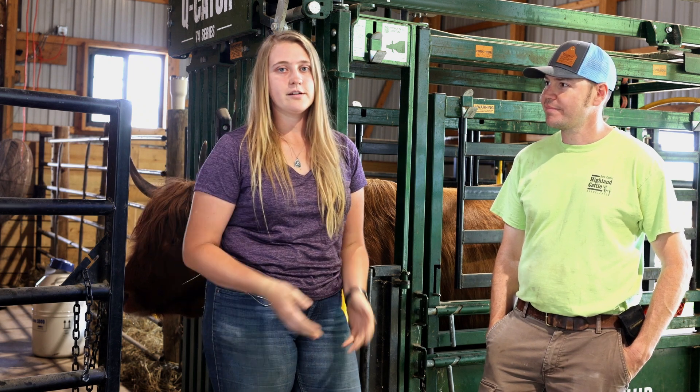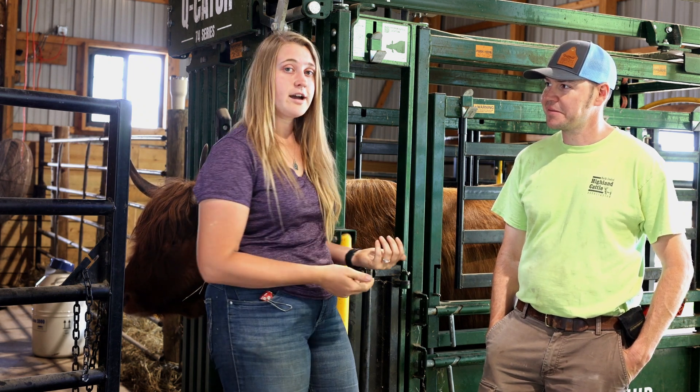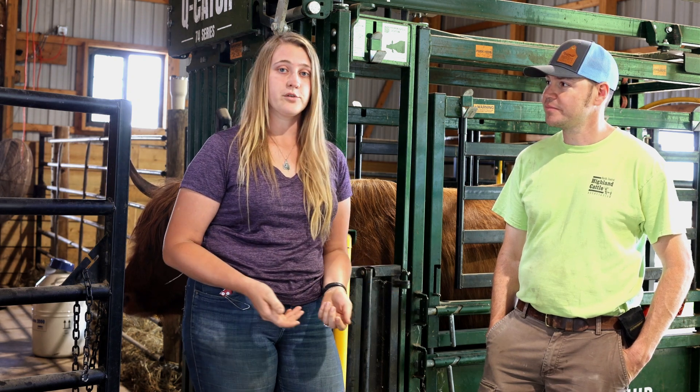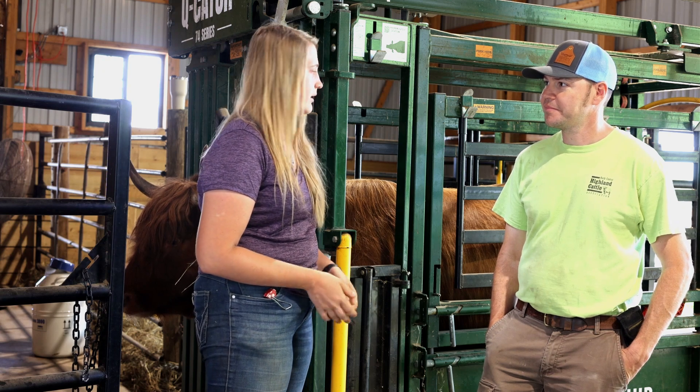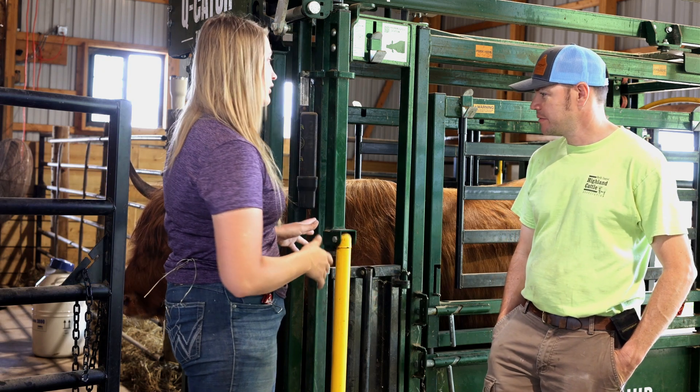Hey guys, I'm Holly Oftedal. This is Josh Krentz. We are here at Windland Flats today and we're going to do a video about flushing a donor cow and putting those embryos into recipients. So Josh, if you could explain a little bit about the process of setting up this donor cow.